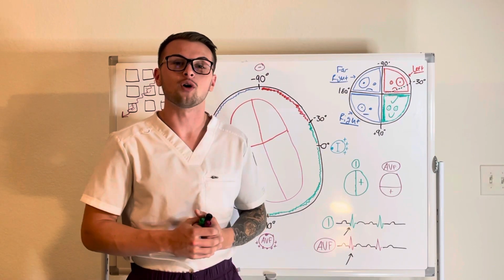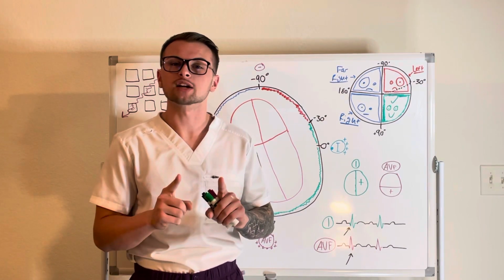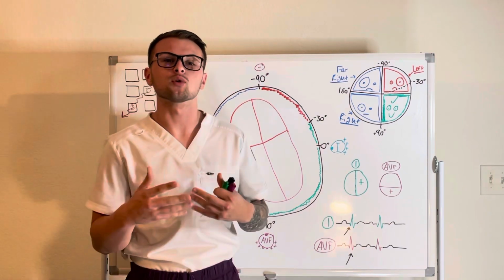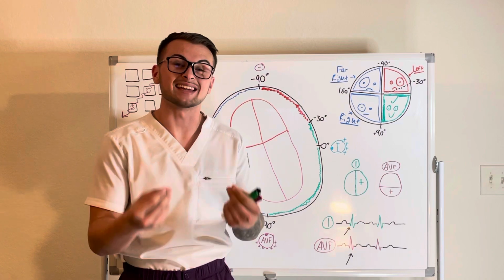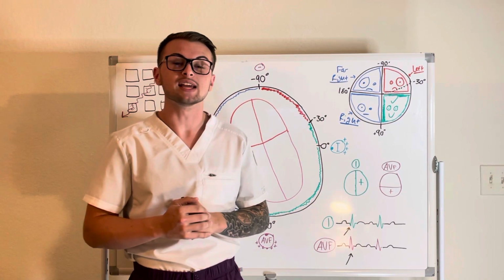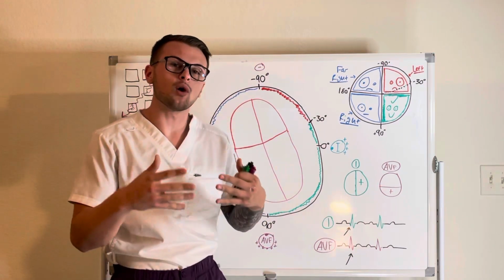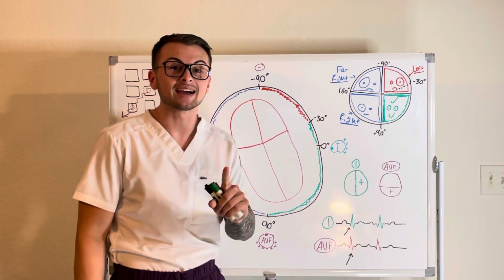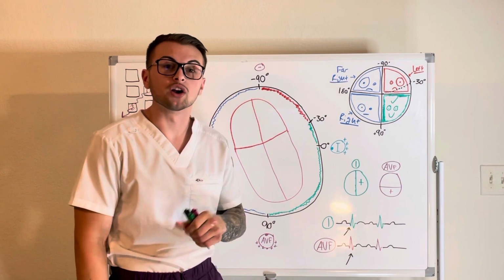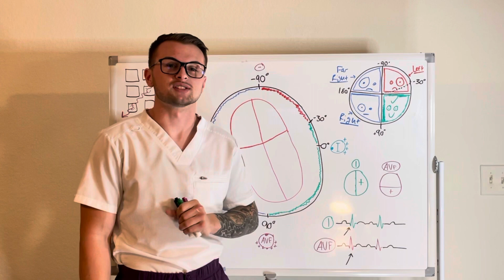Today we are going to go over how to determine if your patient has a normal electrical axis of the heart. Now this is an extremely important concept as it is used as a guide to diagnose a vast majority of the pathologies that we will see involving the heart. So it is very important that we know exactly what it is and how to determine what the electrical axis is on our EKG. So, what is the electrical axis of the heart?